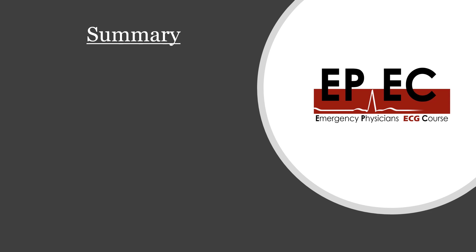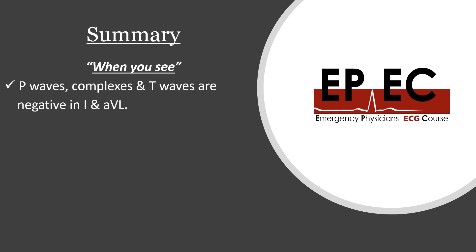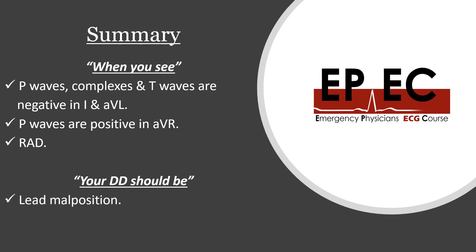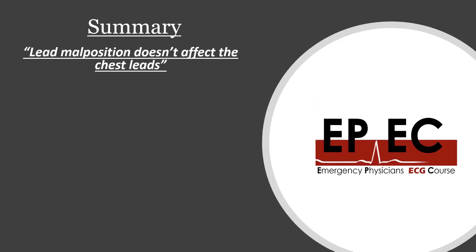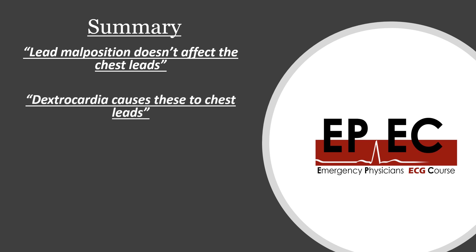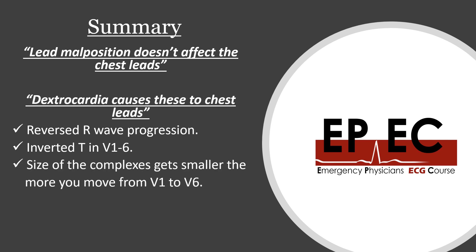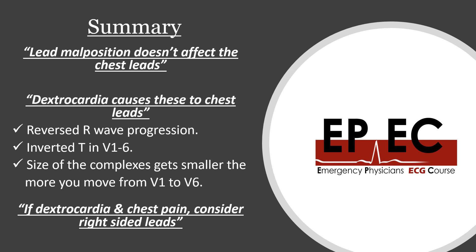In summary: when you see P waves, complexes, and T waves negative in lead I and AVL; P waves positive in AVR; and right axis deviation — think of two conditions: lead malposition and dextrocardia. Check the chest leads, because dextrocardia affects the chest leads while lead malposition does not. In dextrocardia, expect reversed R wave progression, inverted T waves from V1 to V6, and QRS complexes getting smaller from V1 to V6. If a dextrocardia patient presents with chest pain, consider right-sided leads.